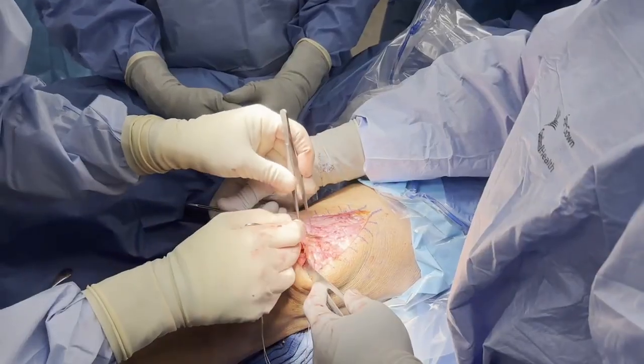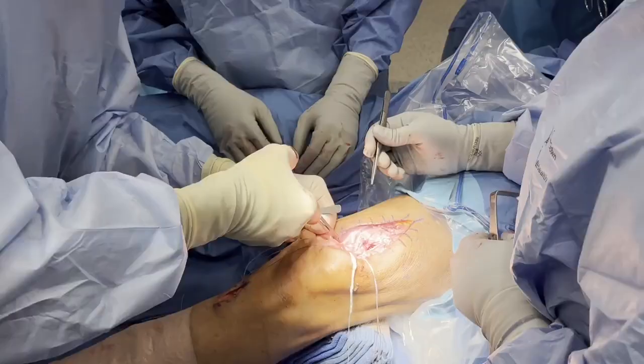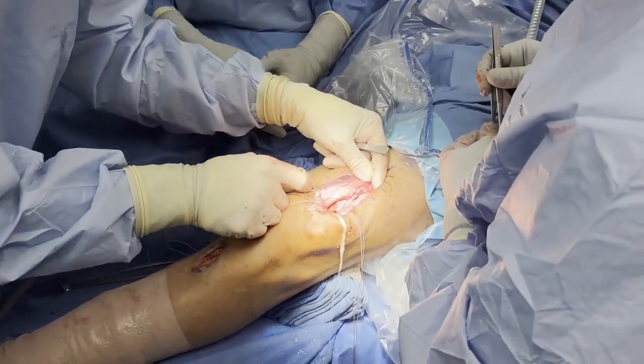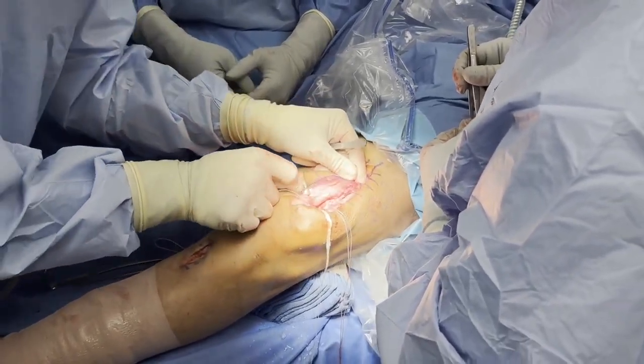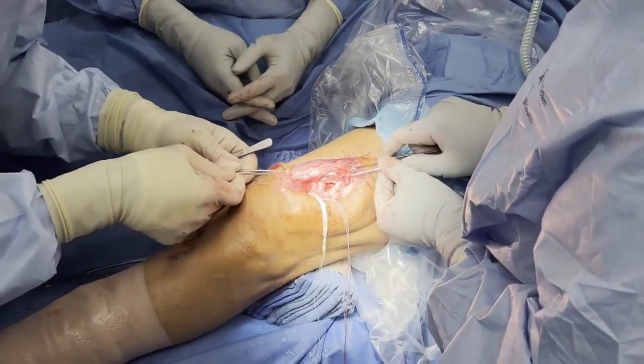Approximately 3cm of the quadriceps tendon is split vertically to create medial and lateral flaps. The medial and lateral soft tissue tunnels are then created adjacent to each patellar aperture. First, they dive inferior to the retinaculum and quadriceps tendon, and both end near the proximal aspect of the vertical quadriceps tendon incision.